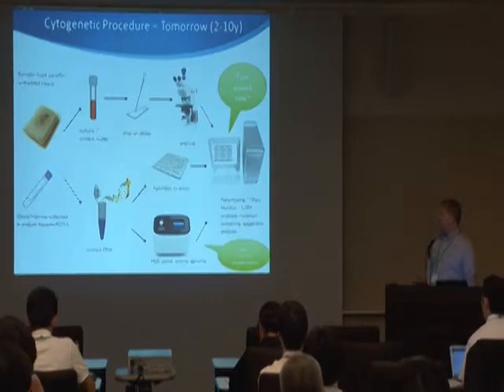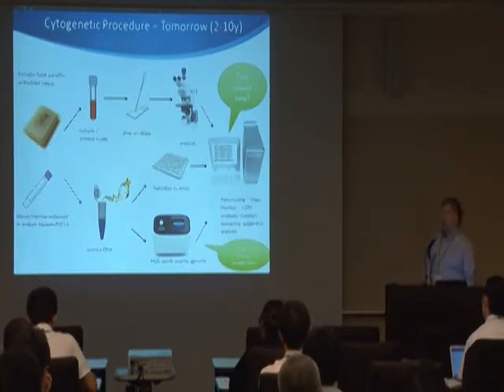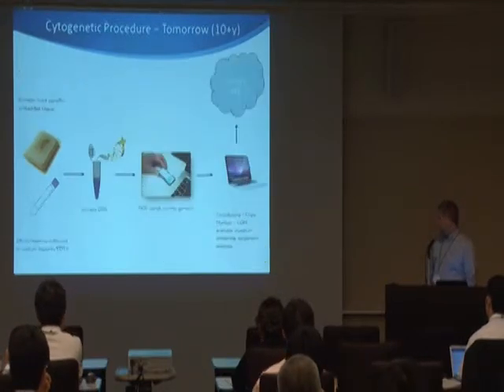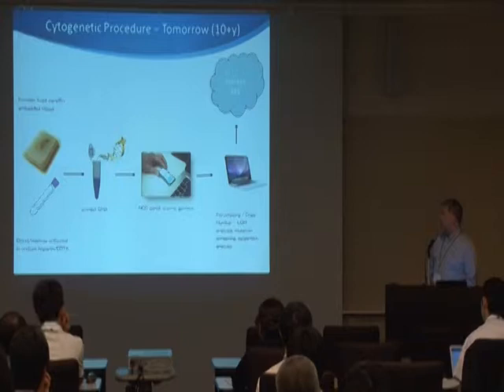And so as things become more and more complex and we get more and more tools in the lab, of course, we have to think about other considerations always, like what's the turnaround time, which is always an important consideration, especially in cancer cytogenetics. What's the cost, and are there any ethical considerations to doing high throughput screening? And so a lot of people see this as the ultimate future for molecular diagnostics, but it's still a fairly long way away, depending on how you want to define that.